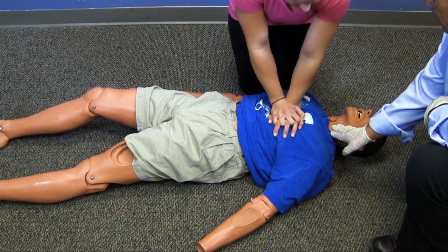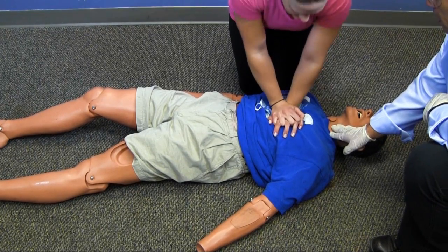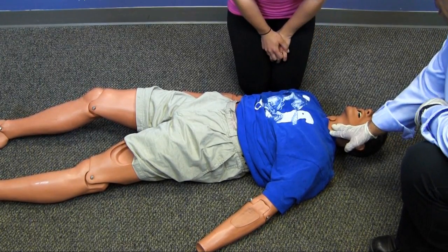After I have determined that the patient is unresponsive, I will perform a scan looking for signs of respiratory effort. I'll check for the presence of a carotid pulse. This should take no less than 5 seconds and no longer than 10 seconds.